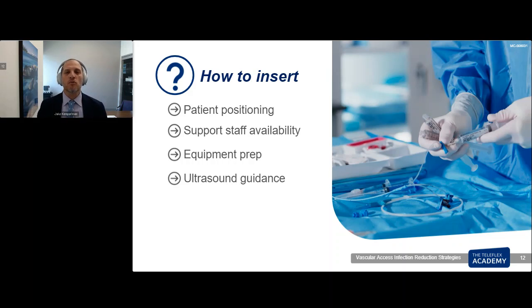We all know that we don't use every piece of equipment that comes in every central line kit, A-line kit, or anything like that. So get rid of the things that you don't need. Get rid of your trash as you go along. Make sure that you are appropriately handling your sharps and other devices that can injure you or someone else.